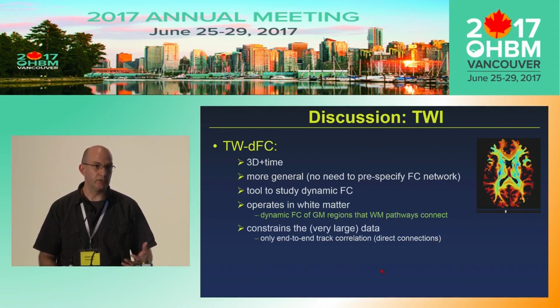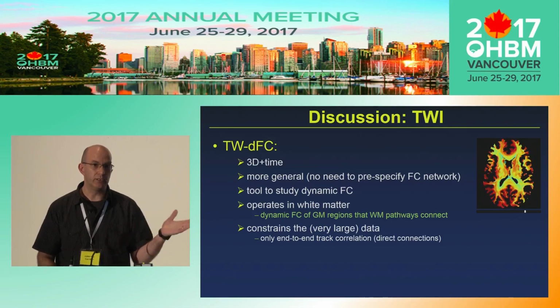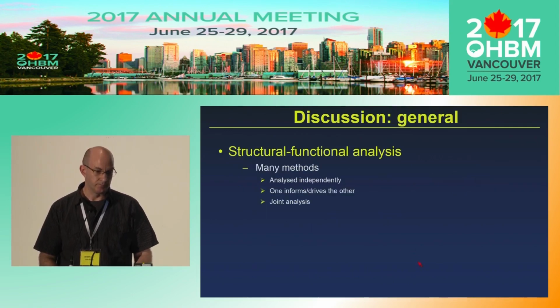If you were to do this directly in the whole brain data, you would need to consider the connectivity between every voxel and every other voxel in the brain, which is hugely dimensional. So we're looking at the direct connections.